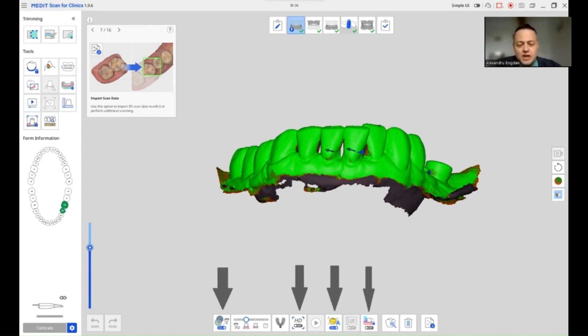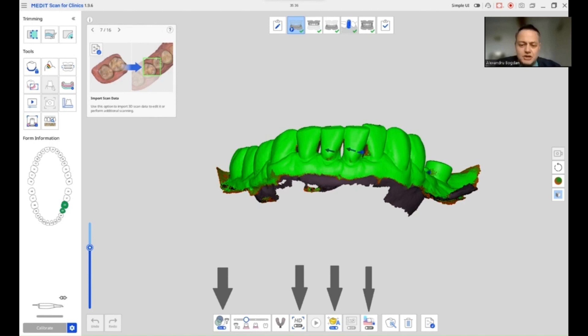I'm going to check the scan metal function and I also will disable slip checker. I don't need the system to re-evaluate every image I take, so slip checker will stay off.